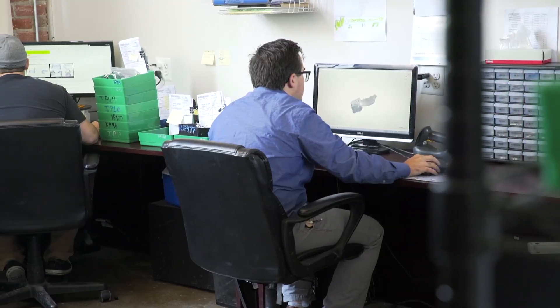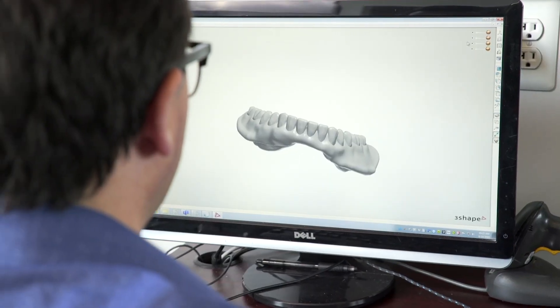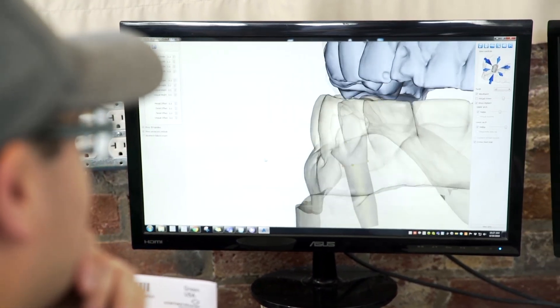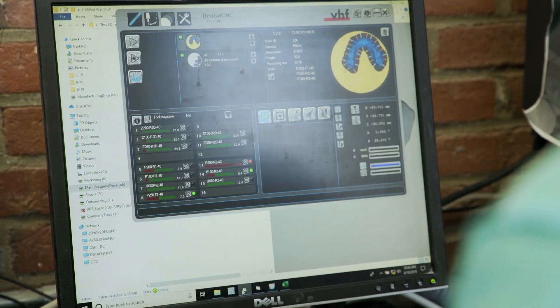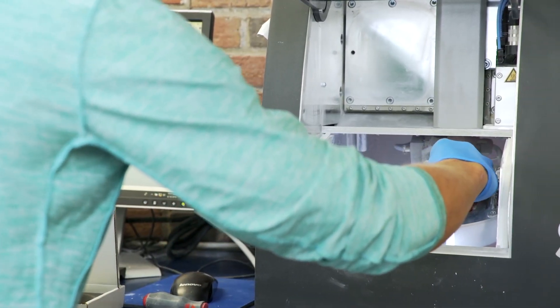The process starts on the computer where a digital design team creates the template for a perfect denture. Using CAD, a designer will create the digital image for the final denture. The files are imported to the mill where the machine begins forming the Key Mill denture base disc into the denture.